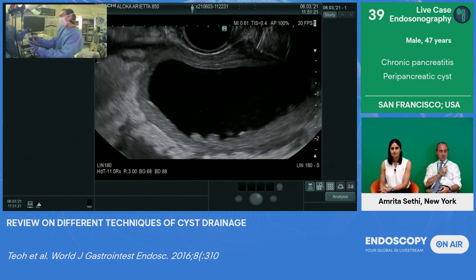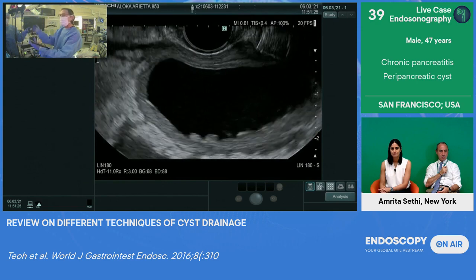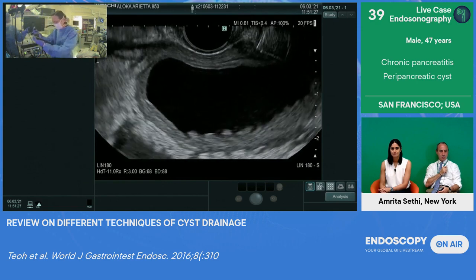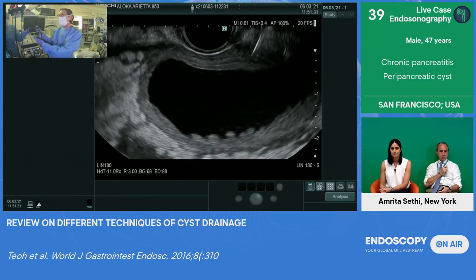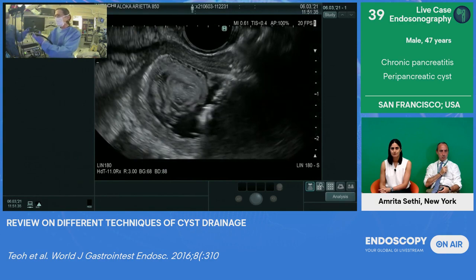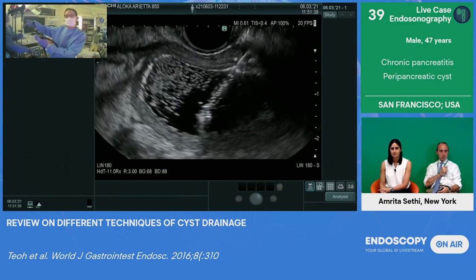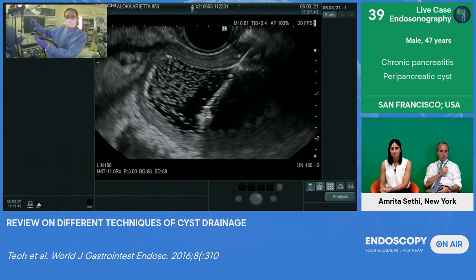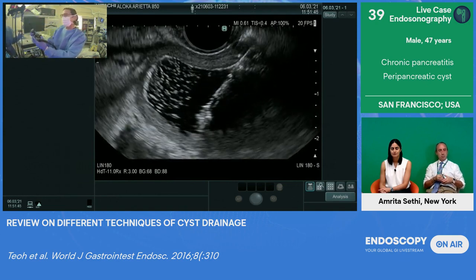And so what I'm doing now is I'm just pushing the sheath forward, like an FNA needle, and I'm just advancing that sheath forward, and I'm stepping on pure cutting current to go in. And I'm in. Now, once you're in, you get some bubbles from the diathermy. Courtney just disconnected immediately so that I don't end up burning through the opposite wall.